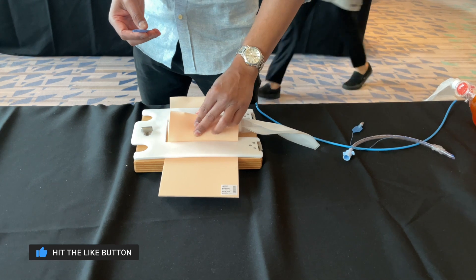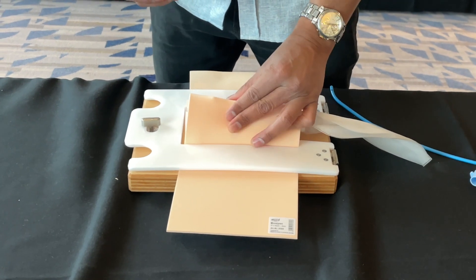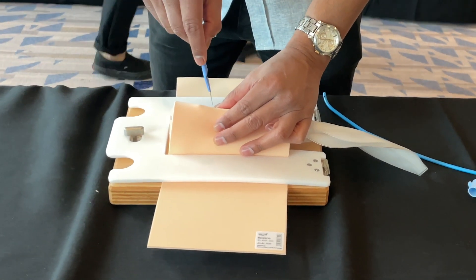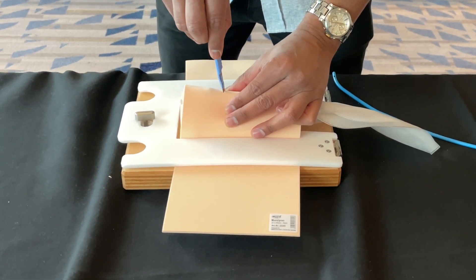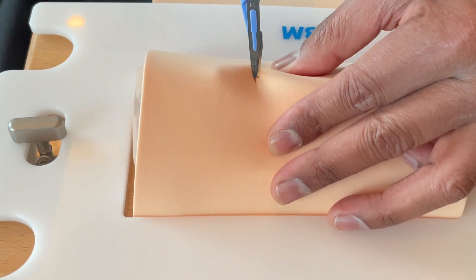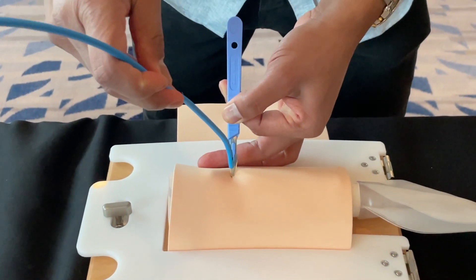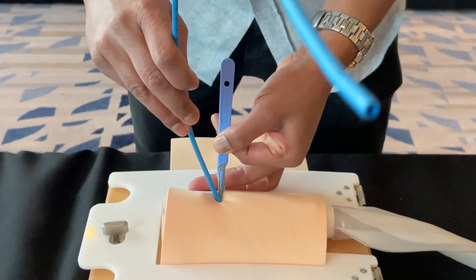I'm standing on the left side of the patient because I'm right-hand dominant. I perform the laryngeal handshake, finding the cricoid cartilage and thyroid prominence — that's your cricothyroid membrane. I hold the larynx with my thumb and forefinger, then use my scalpel to make a horizontal incision on the cricothyroid membrane. I then point the scalpel down and turn it vertically, creating a triangle where the bougie will slide. I swap hands and pass the bougie along the surface of the blade.